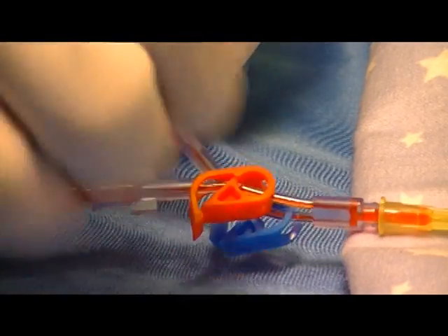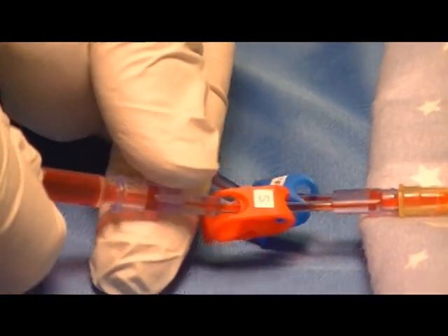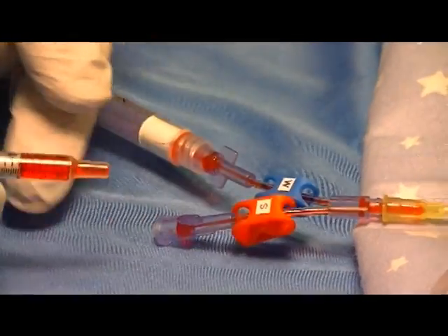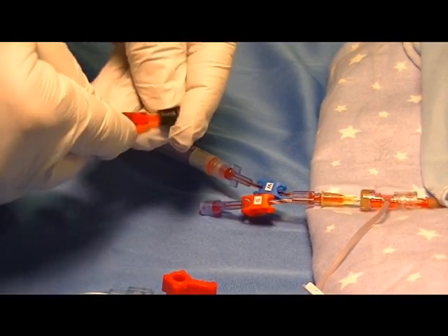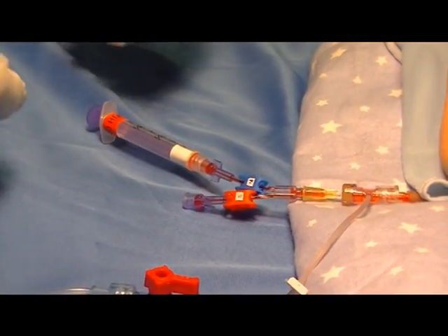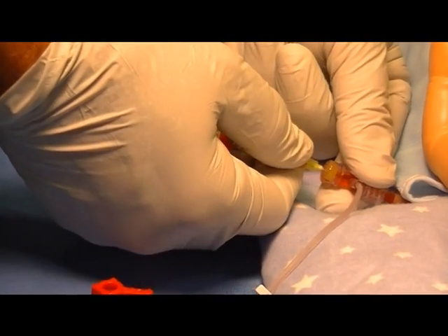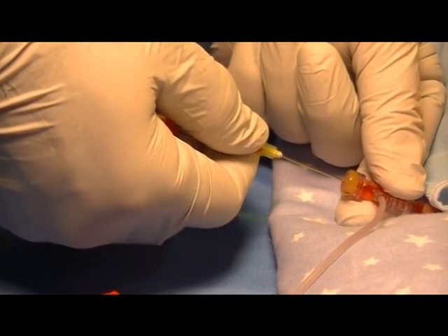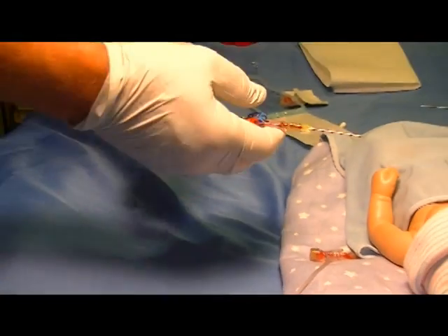Once the waste is given back, reclamp the blue clamp and go to the sample side, remove the sample, cap it, and send for testing. Then remove the Humi from the T-connector slowly and dispose of the Humi and the waste syringe in the appropriate sharps container.